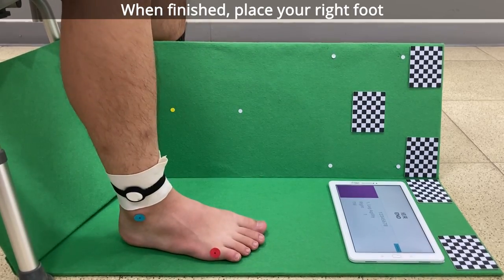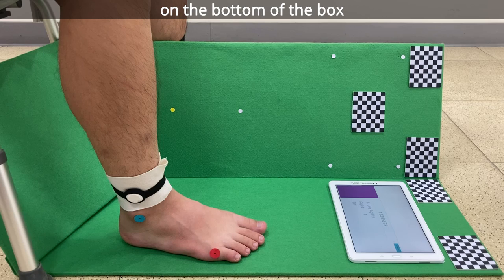When finished, place your right foot on the bottom of the box. Start when the tablet says start.